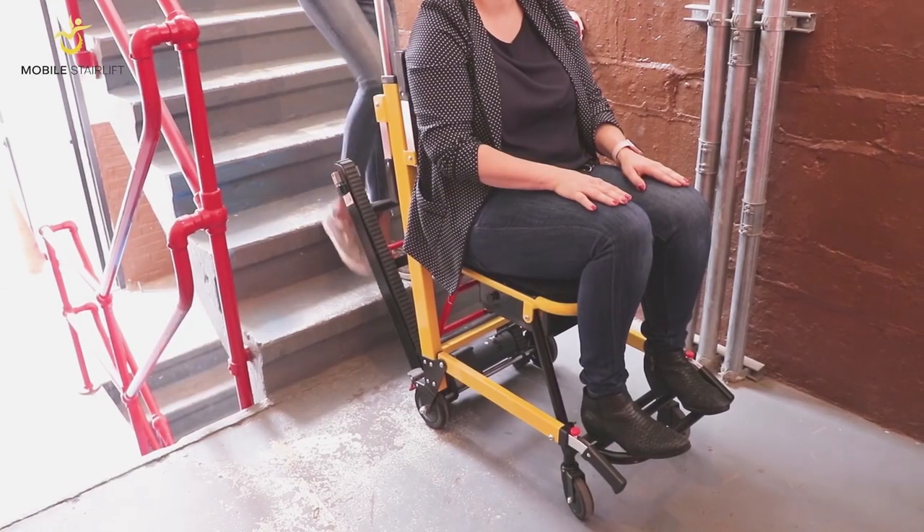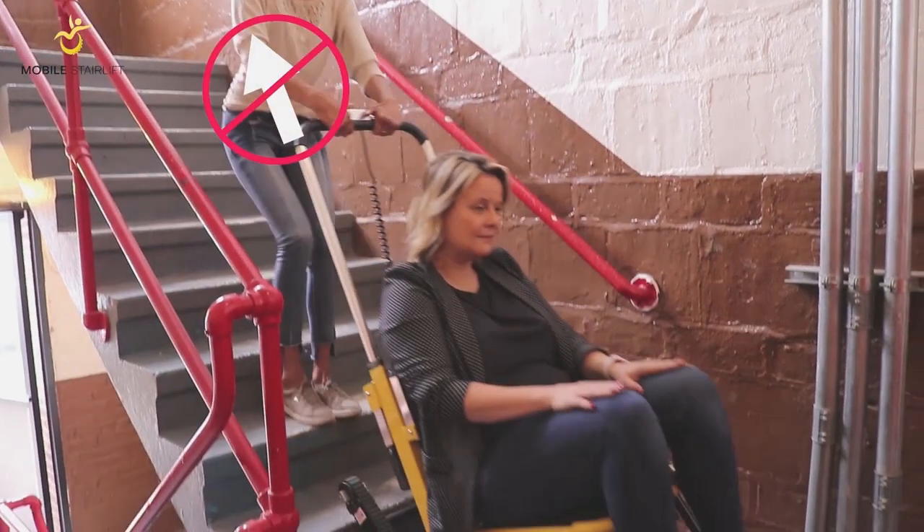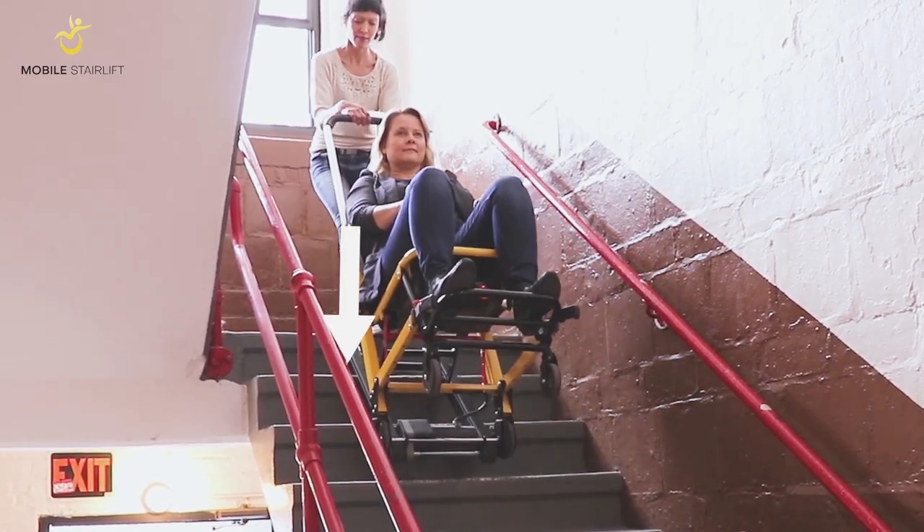To ascend a staircase with the Mobile Stair Lift, you should never be pulling the Stair Lift towards your body. Instead, pull down on the handle towards the stairs to ensure maximum contact between the treads and the stairs.